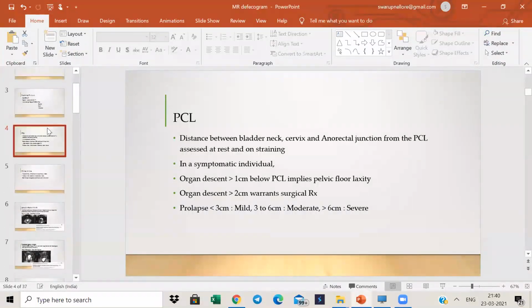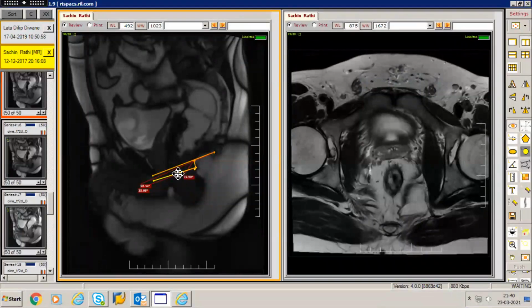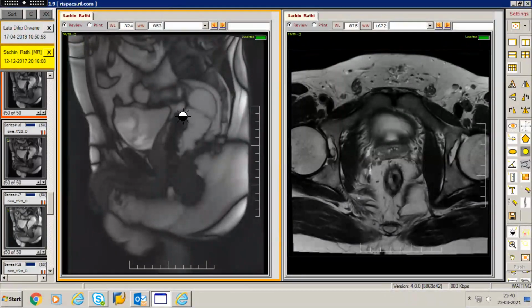One thing, Saru, you have to also show them, and guys, whoever's attending this, remember that the anorectal angle in many articles is given a range anywhere from 105, 108 to about 125, 127 degrees. When you look at either extreme of the maneuvers, that is a squeeze where there is acuteness of the angle, or defecation where there is more obtuseness of the angle, the gradient on either side is not going to be more than 15 to 20 degrees. If the gradient is more, especially towards the squeeze, it usually means that the puborectalis is dysfunctional. And you have to be concerned about that.